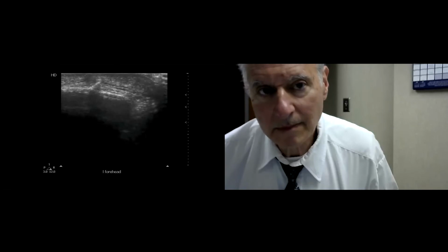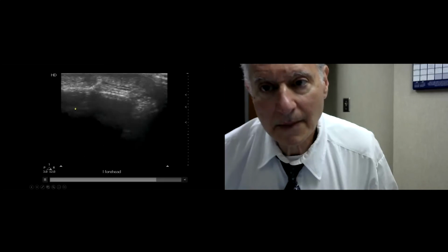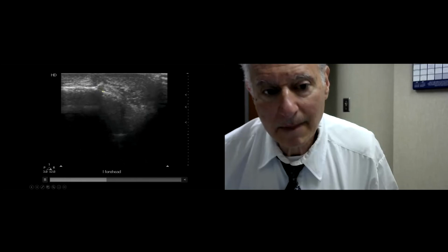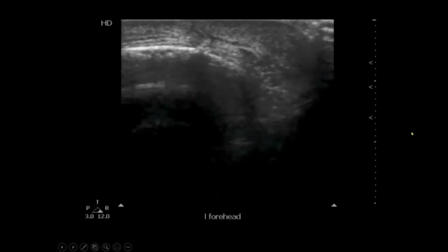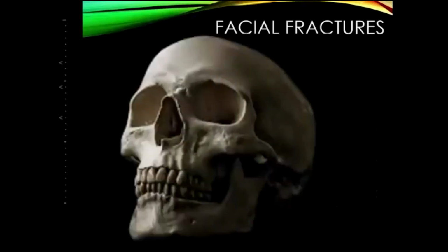And I had just been looking at diagnosing pediatric skull fractures with ultrasound, and he didn't have a remarkable fracture, but you can actually see that the skull table is fractured there. So it was diagnostic, and of course he had no underlying injury with that.